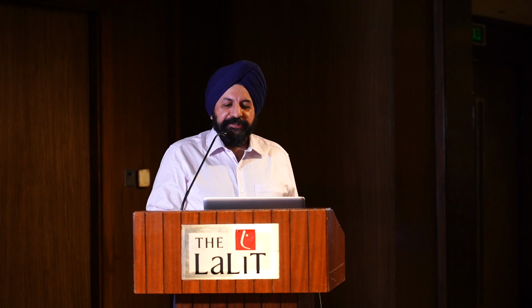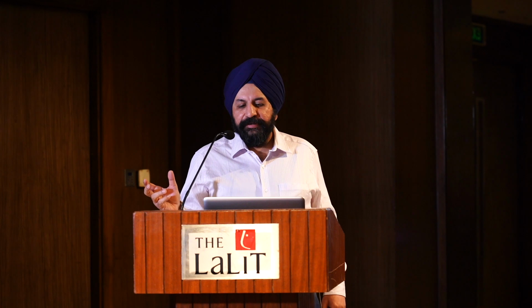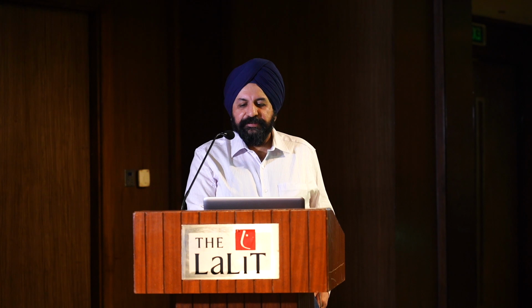Coming next to optical RBCs. Whenever in an analyzer the RBCs are isovolumetrically spherized, as we do for retic count, the Mie theory of light scatter for homogeneous spheres comes into play. The low angle scatter determines the volume and the high angle scatter determines the hemoglobin concentration. You can do this test only after fixing the RBCs, so if you don't have reticulocyte measurement in your analyzer, then this test is not possible.